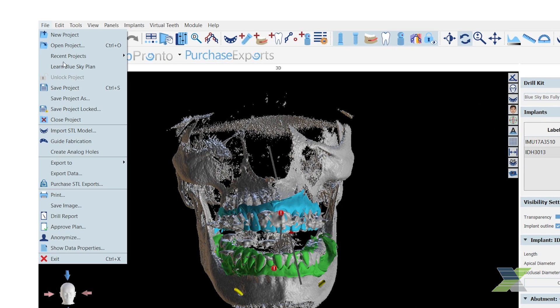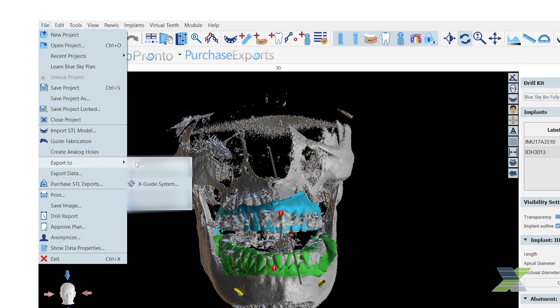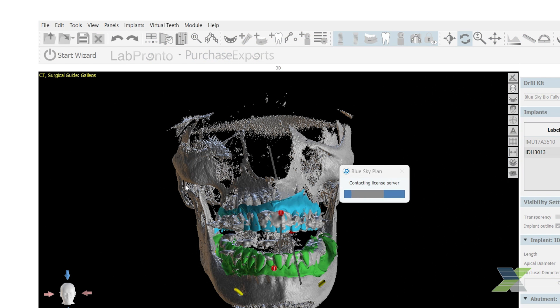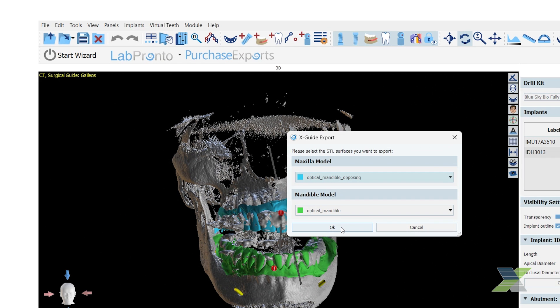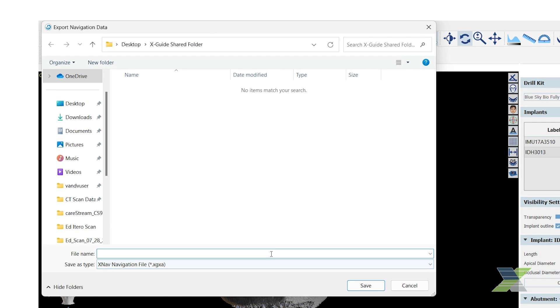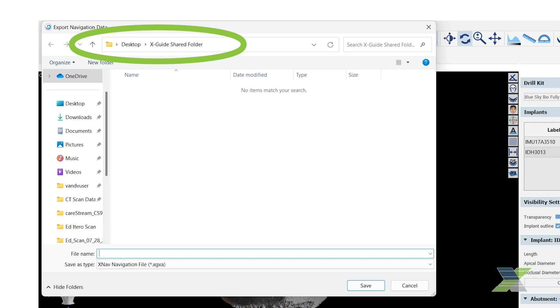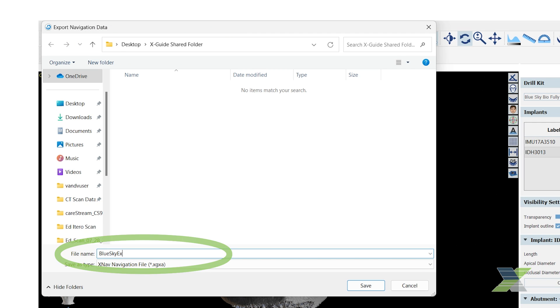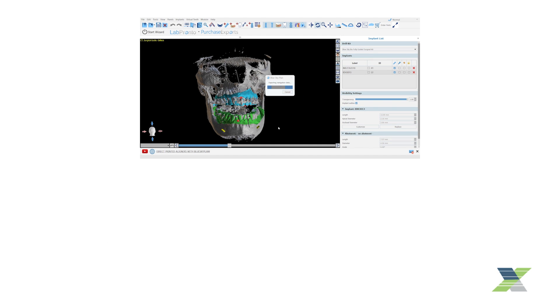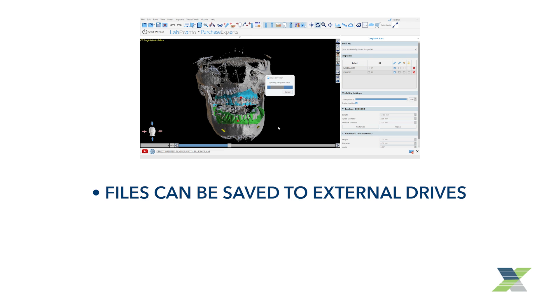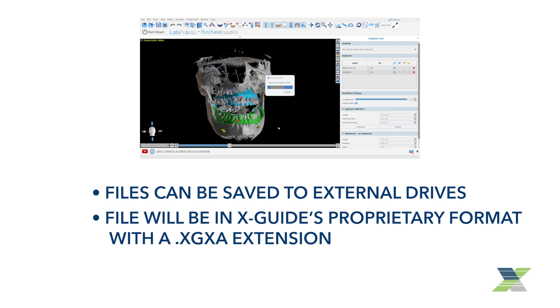If you imported any STL files into this case, you'll be prompted to select any STL files you want to export with the case and then click OK. In the Export Data Browse window, select the desired file folder to save to and name the file, then click Save. In this example, we are saving to a shared folder, but you could also save to an external USB drive. The file will be saved in XGUIDE's proprietary format with a .xgxa extension.